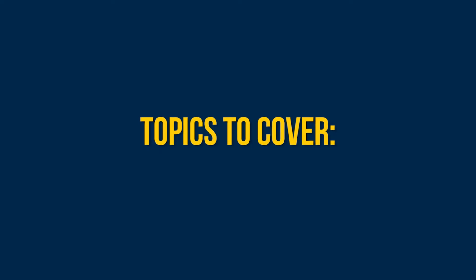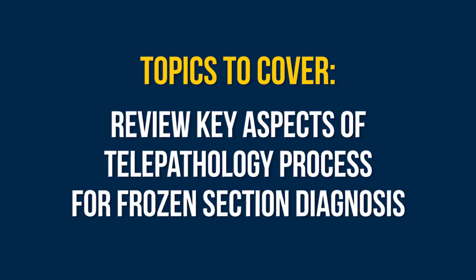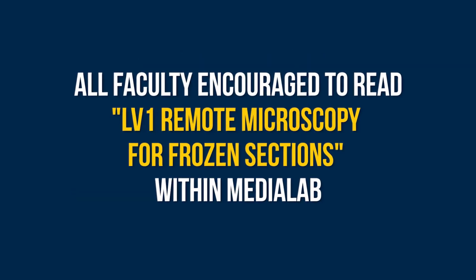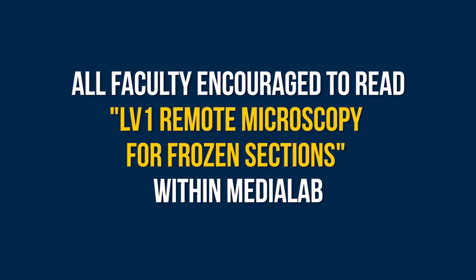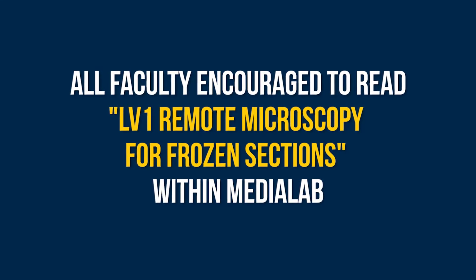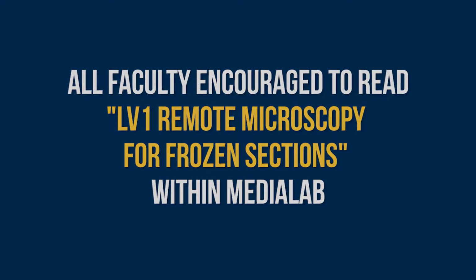This video will review the key aspects of the telepathology process for frozen section diagnosis using the Leica LV1 remotely operable microscope from the pathologist's perspective. All faculty who may engage in LV1 telepathology are strongly encouraged to read the approved procedure document titled LV1 Remote Microscopy for Frozen Sections in Media Lab.